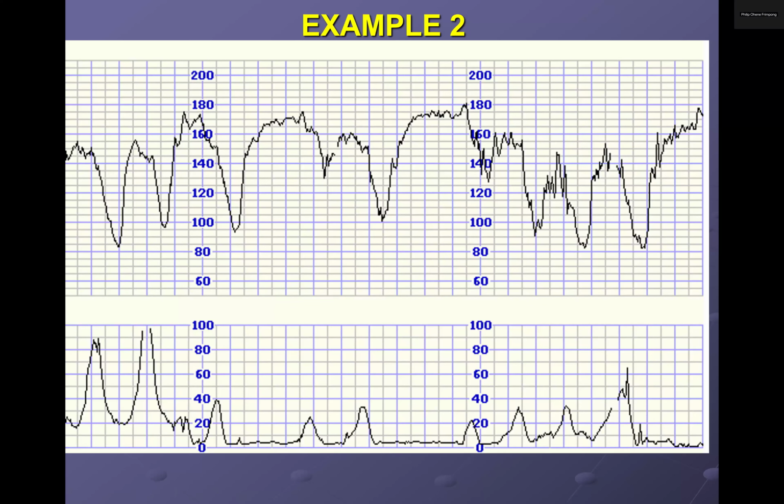That's tachycardia. That's abnormal. Exactly, that's tachycardia. And you can see it both here and here. I mean, here it's difficult to say what's happening, but definitely this here is a high baseline rate and not an acceleration. So not looking good, right? So that's the baseline rate.